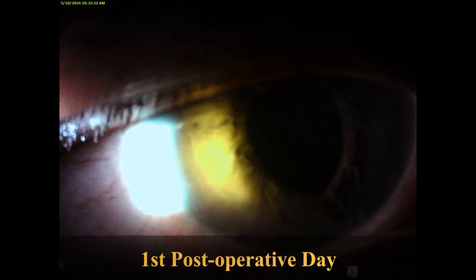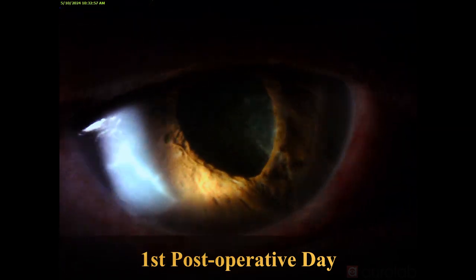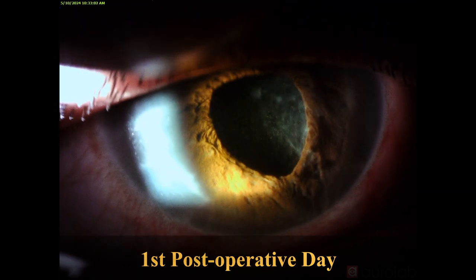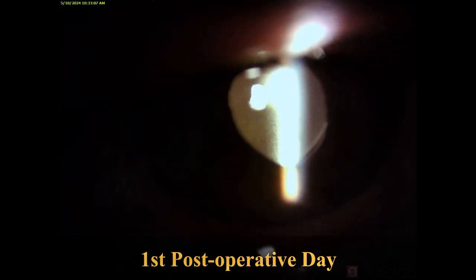This is the first post-operative day video of this case. In retroillumination, the fundus glow via the iridodialysis area is no longer visible, which was present preoperatively.